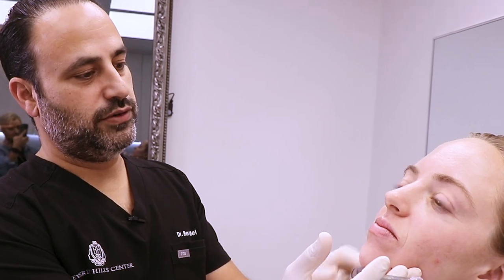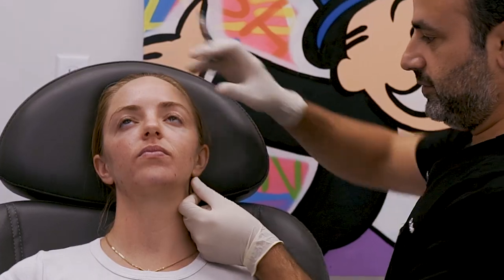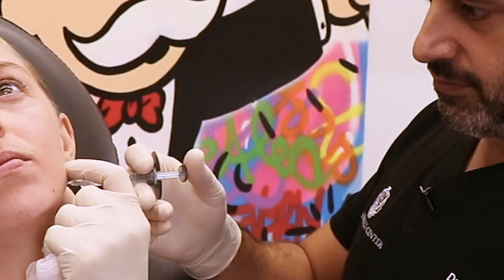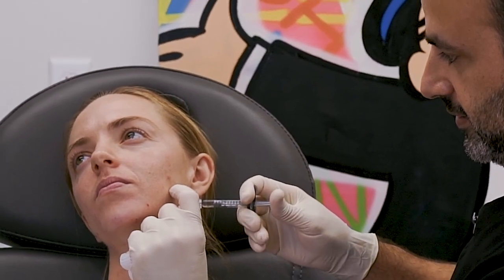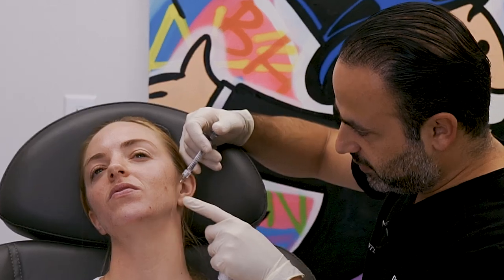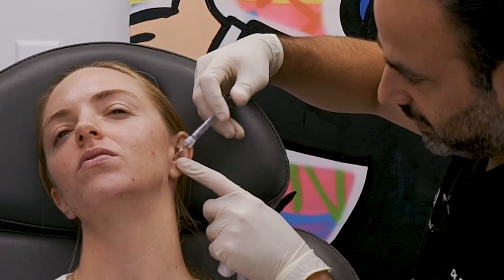Once you touch the bone, the needle's dull — you have to change the needle before you inject again. I'm going to push on the gonial angle of her mandible, put my finger on it, come right on top of the bone. Do not go posteriorly accidentally and inject — there's a big vessel, a big vein there. So that gave her the strength she needs. On this side she doesn't need much else. I'm going to build her up in the pre-parotid fascia to help make the top of the mandible look a little tiny bit stronger.